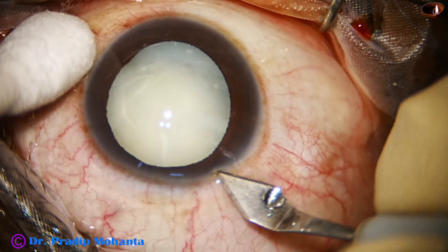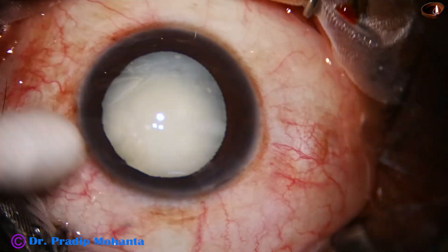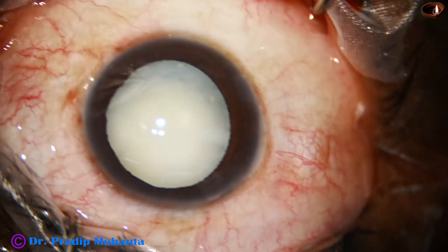This is a white cataract but the nucleus is very soft. This is the main incision with a 2.8 millimeter steel keratome, and the incision is just on the posterior aspect of the limbus.